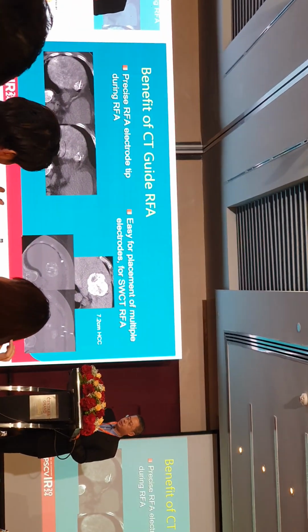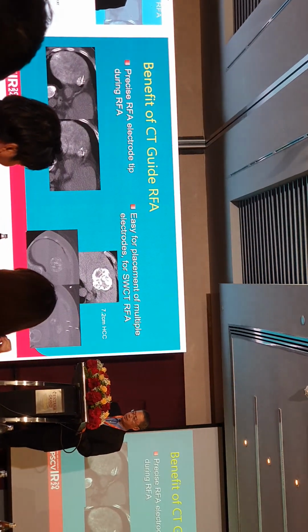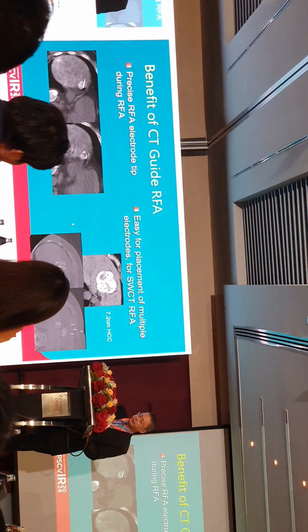And for a large tumor, we can place 3 electrodes simultaneously at equal distance from each other and parallel to each other. And the center one is a biopsy needle.